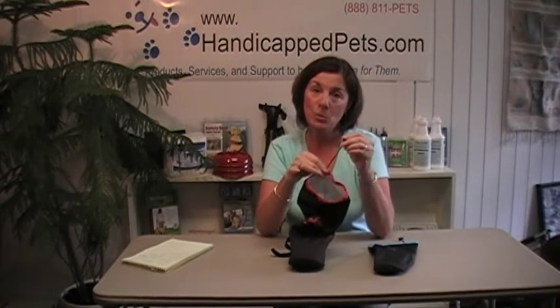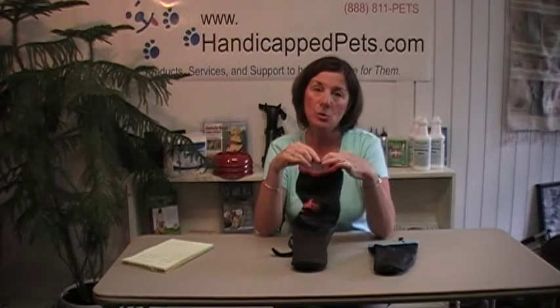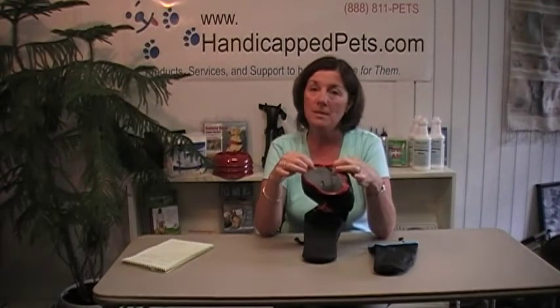I do suggest once you pull this tight, tuck that toggle switch on the inside — your pet's going to love chewing on it.